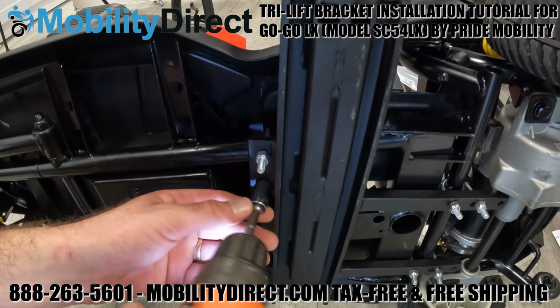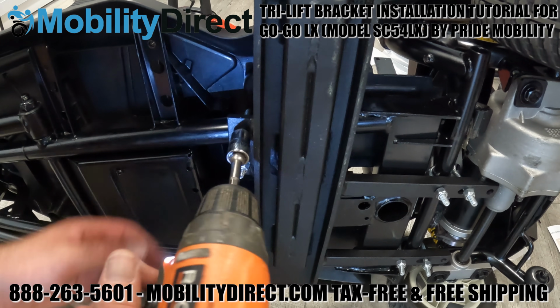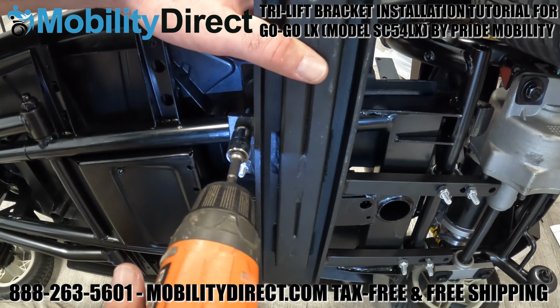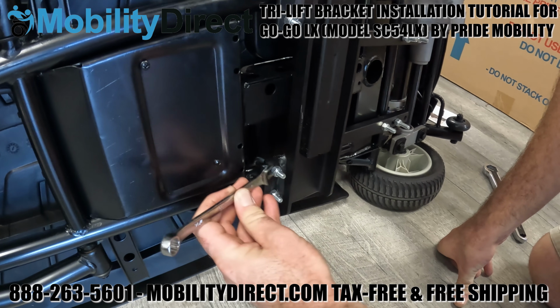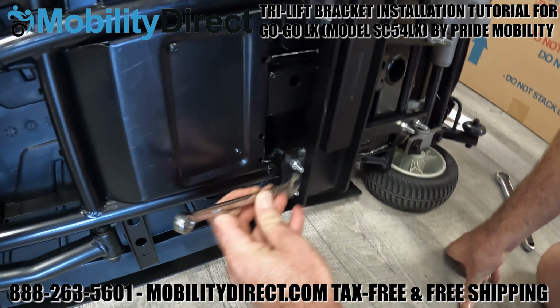You might need a deep socket to get the bolts all the way tightened. You want to make sure they're very tight and very well secure. If you don't have a deep socket, you can use a little manual wrench. Just do what you need to do to make sure that they're all tight.